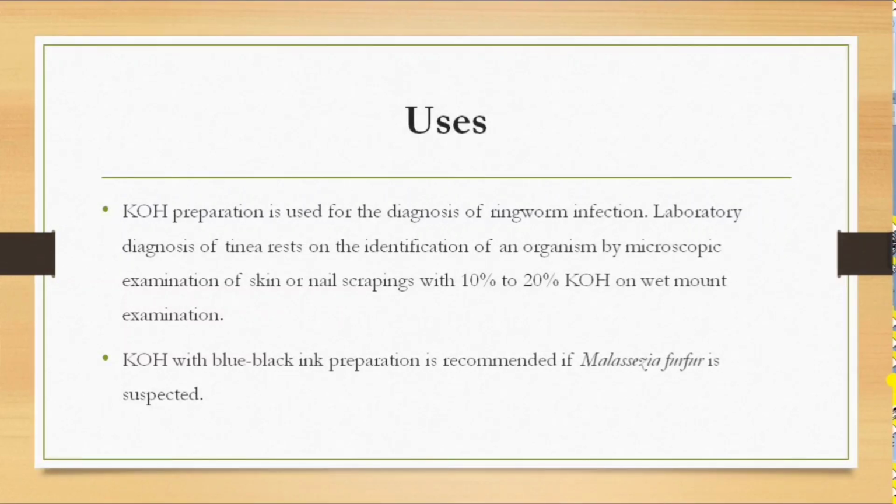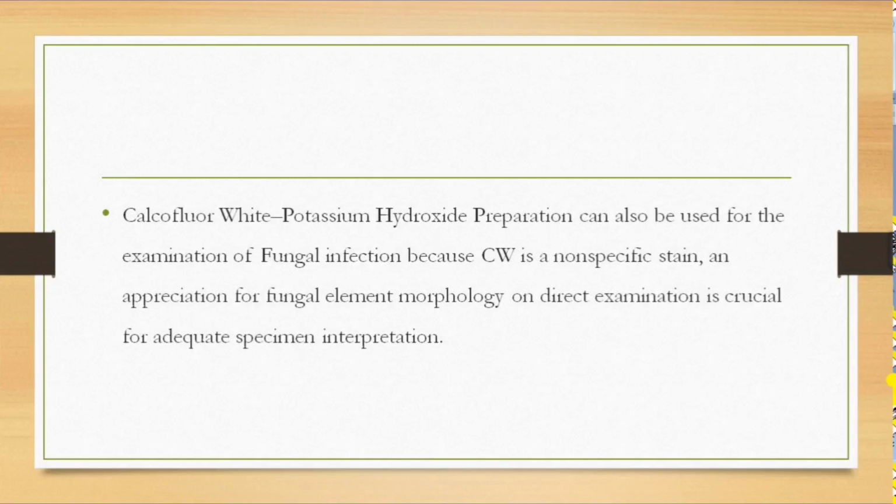KOH with blue-black ink preparation is recommended if Malassezia furfur is suspected. Calcofluor white potassium hydroxide preparation can also be used for the examination of fungal infection, because calcofluor white is a non-specific stain.